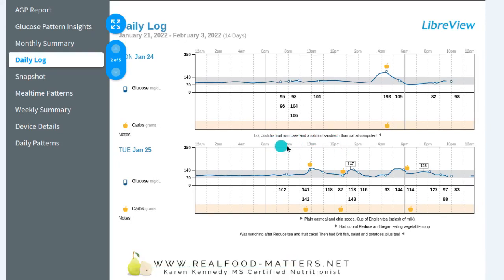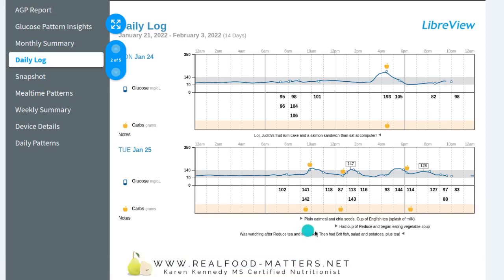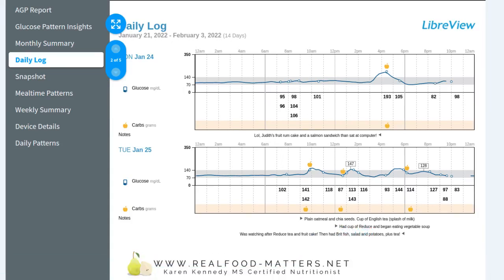So you can see this person wrote — Judith's fruit rum cake and a Salmon Sandwich, and sat at the computer. That's what she ate, and this was the result of her glucose curve afterwards. Here the person made a note: plain oatmeal with chia seeds and a cup of tea with milk. And another note: had a cup of herbal tea and began eating vegetable soup.